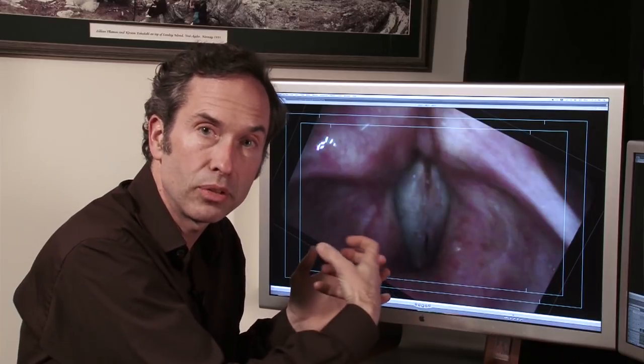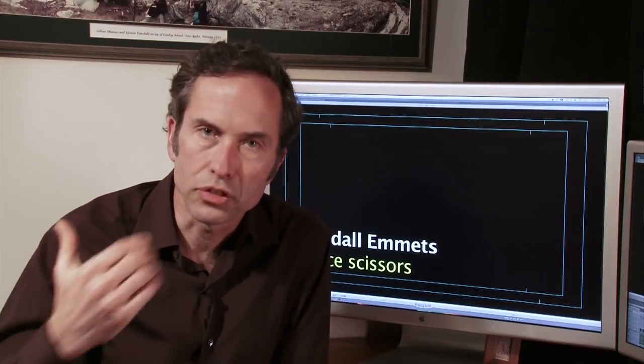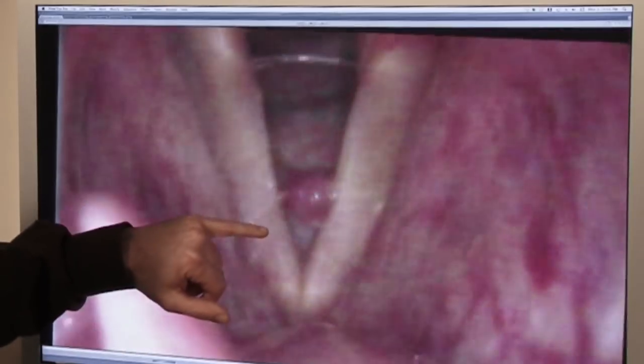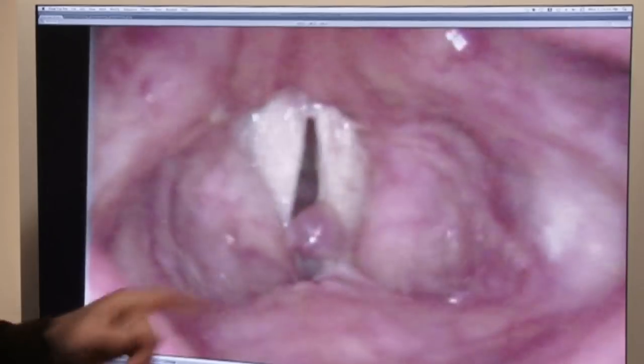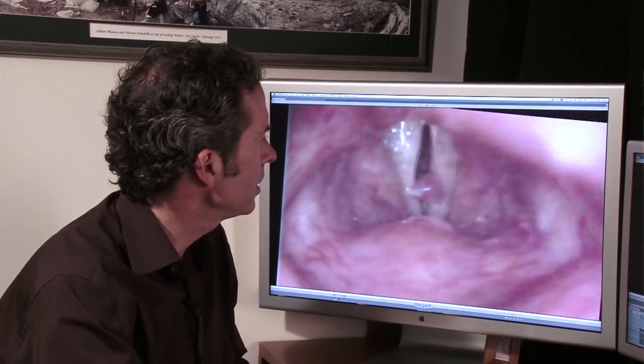He's already much better than when he had a large ball of blood hanging off the end. Randall Emmets is 87 years old. His general ENT found the polyp and said he couldn't operate because of a big spinal spur — he couldn't get the endoscope through the mouth. Randall has a pretty big polyp that causes a lot of roughness in his voice, a lot of air leak, and it flips in and out while he's talking. Again, we're going to operate on him in the office.